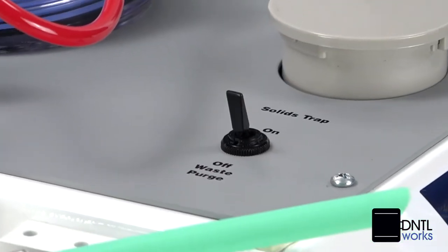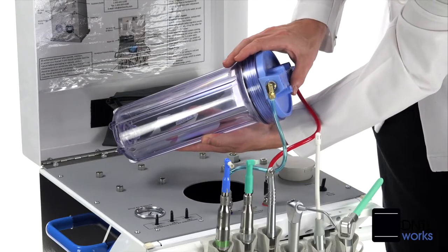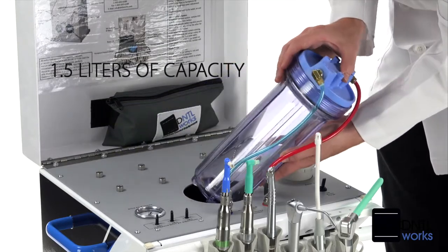We've built in a large waste container with separate electrical purge system and auto-overflow shutoff. The water reservoir offers a full 1.5 liters of capacity.